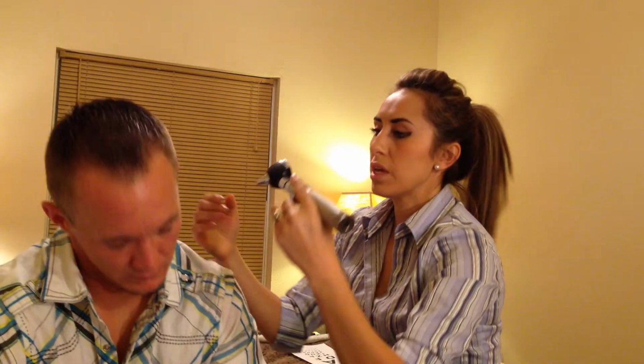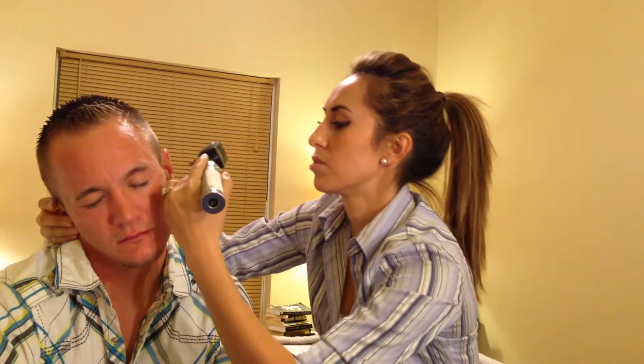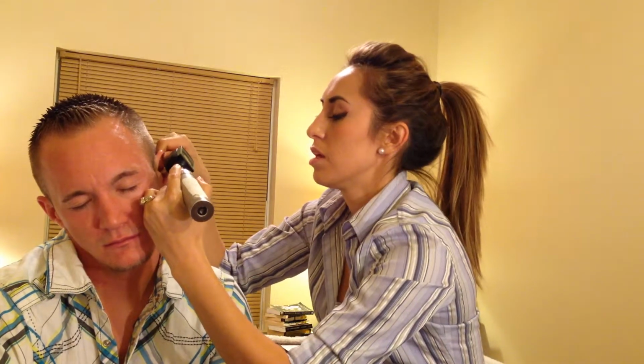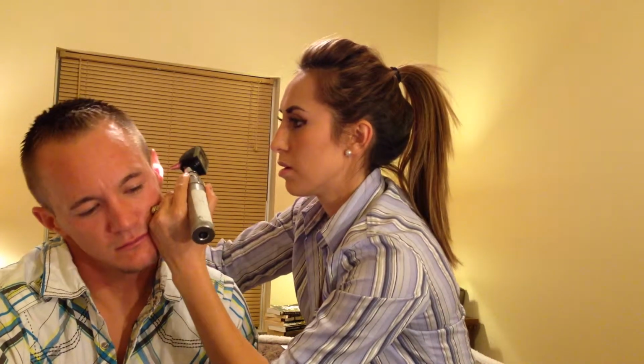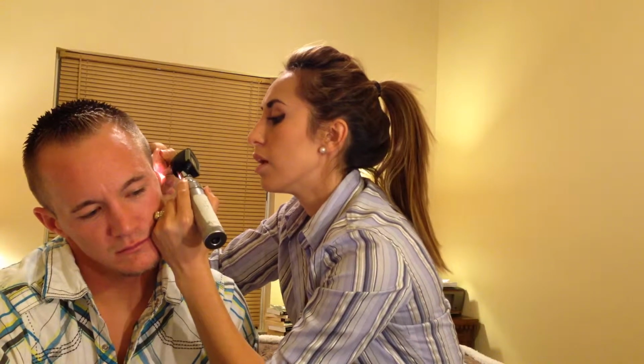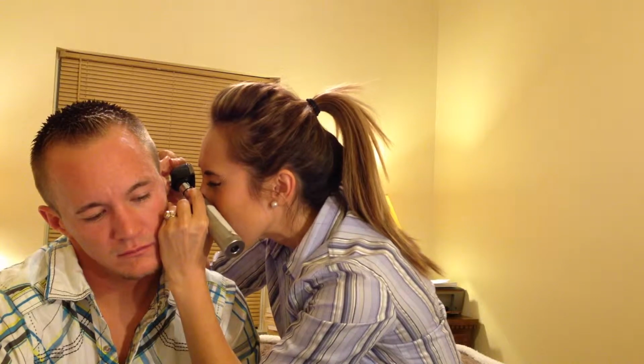One more time, whenever we're going into the ear, just make sure that you keep your head straight, just like that. Tilt your head toward the opposite side of your shoulder, and then we pull the auricle up and back to make it easier to see. The otoscope itself has a little light here, and you want to make sure that is on right before the assessment. And then when you do, you want to tilt your head a little further, and then up and back, and that's when you start looking at the canal here.